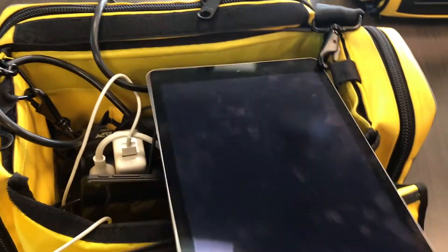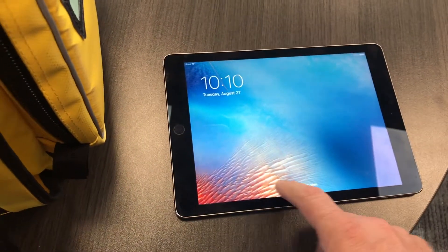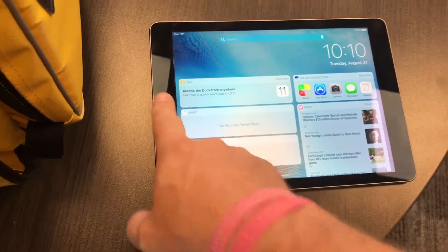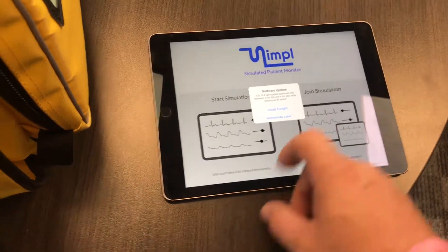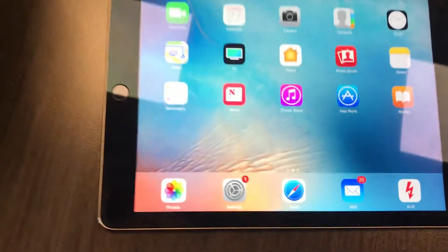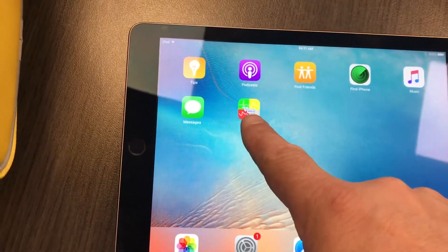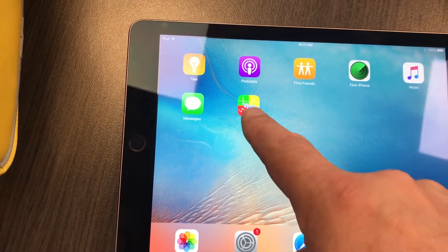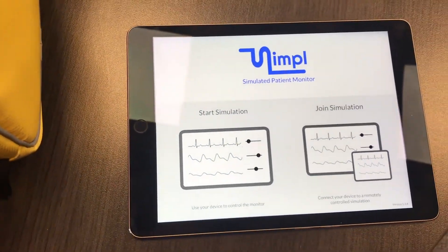iPads work like iPads work. You can turn it on at the home button, go ahead and slide it open. Go to the home button and find the app, which is on the second page — just slide over to the next page and you can see this app right here. It's SIMPL. Go ahead and click that and open it up.